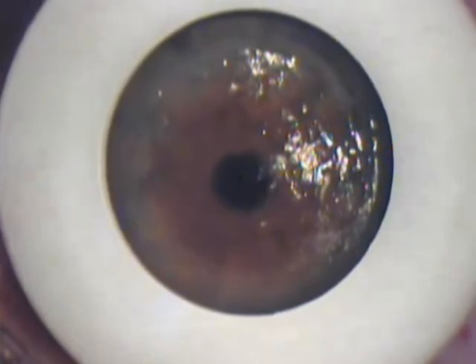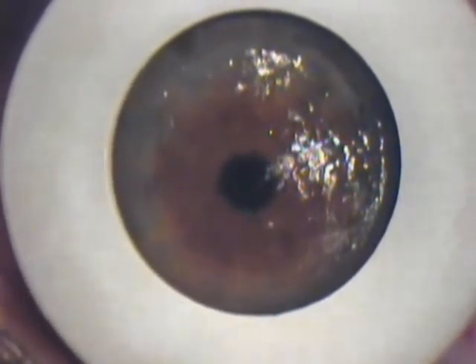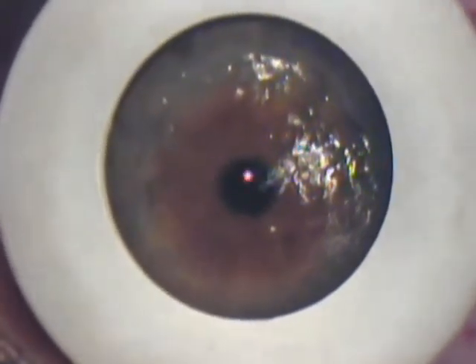We can see at the end of the photoablation how the visual axis has been perfectly regularized, and to some extent we've also improved the periphery.